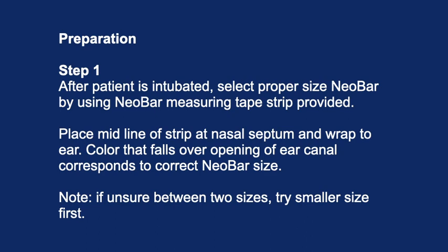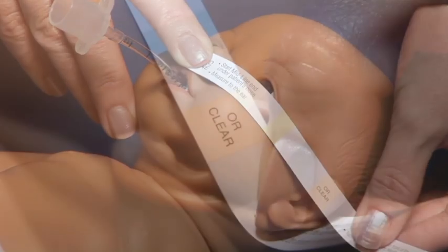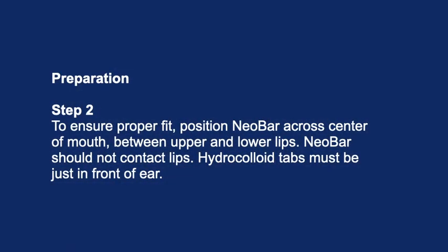Preparation step 1: After patient is intubated, select proper size NeoBar by using the NeoBar measuring tape strip provided. Place the midline of the strip at the nasal septum and wrap to the ear. The color that falls over the opening of the ear canal corresponds to the correct NeoBar size. Note: if unsure between two sizes, try the smaller size first.